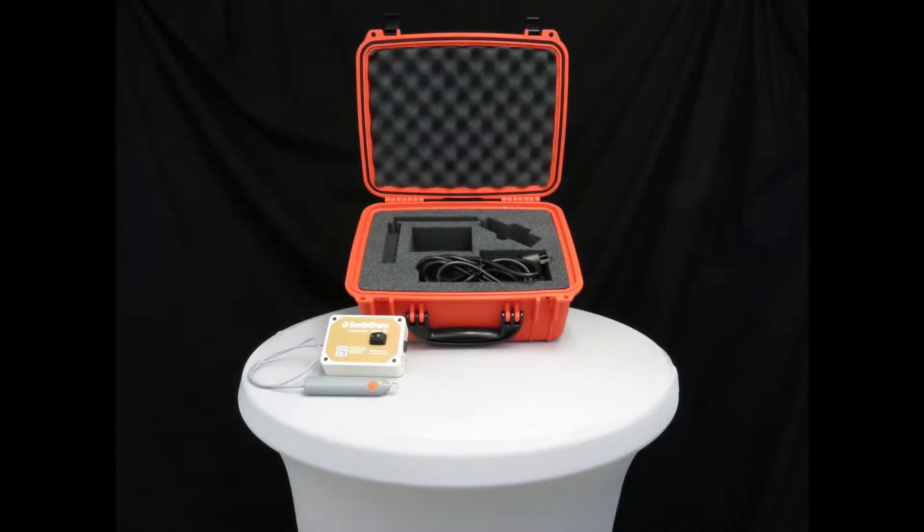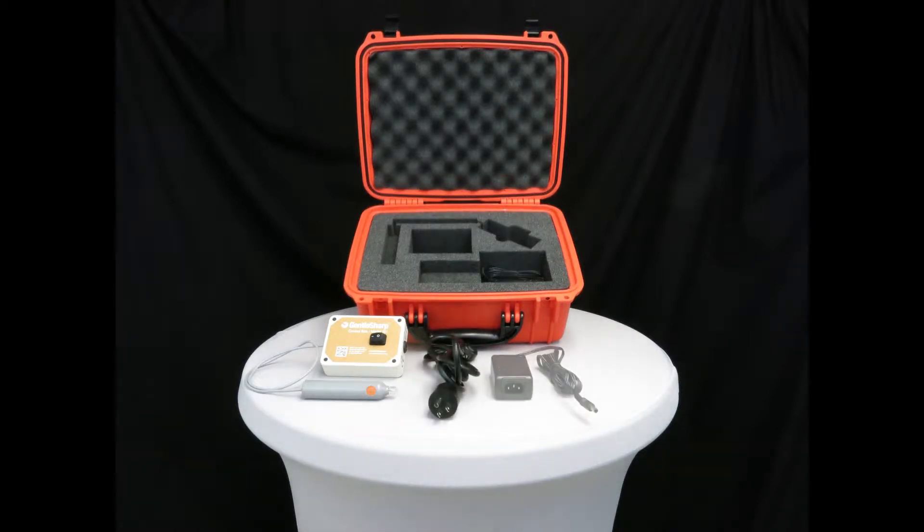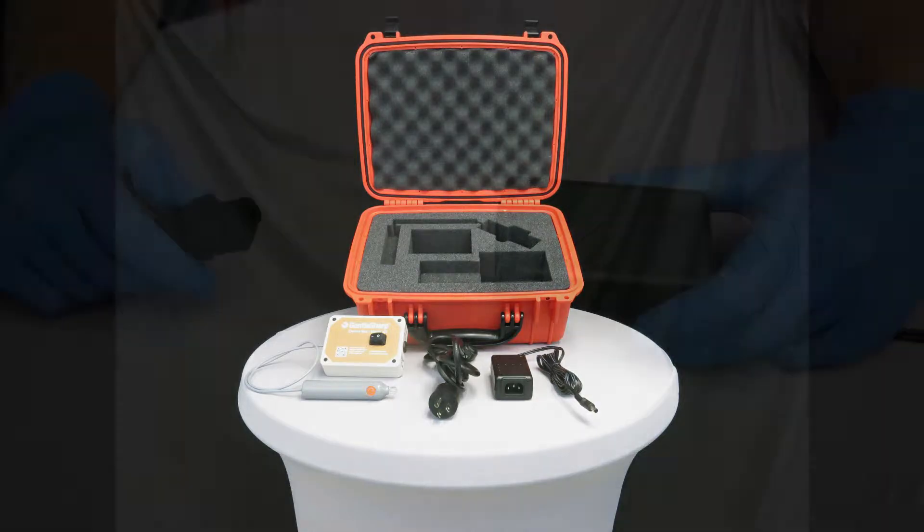Remove the control box and handpiece from the case. Place the control box and handpiece on a sturdy level surface such as a table. This reduces the risk of the control box or handpiece falling. Remove the power cord, power supply, and power supply cord from the case.